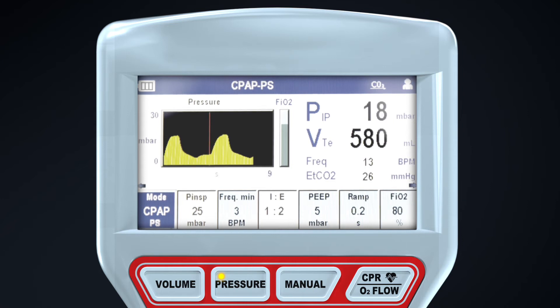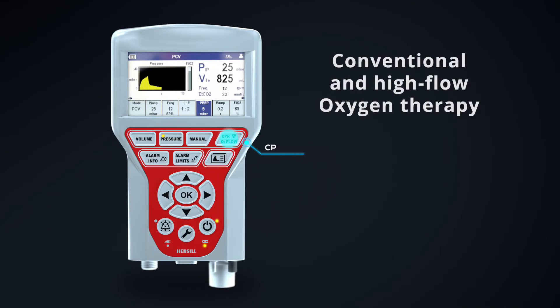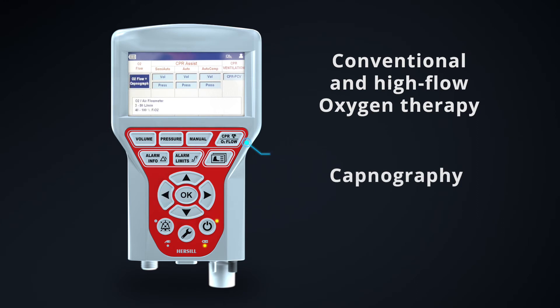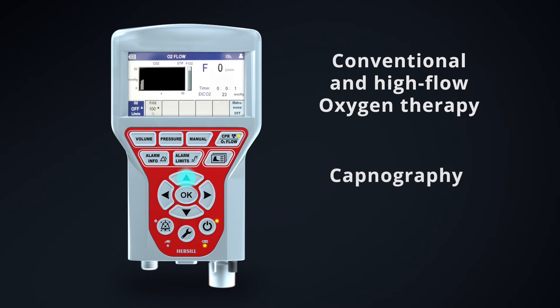Vitae40 allows the administration of conventional and high flow oxygen therapy, as well as monitoring of capnography. We confirm by pressing OK and set the desired flow — in this case, 10 liters per minute — to a patient whose capnography is being monitored.